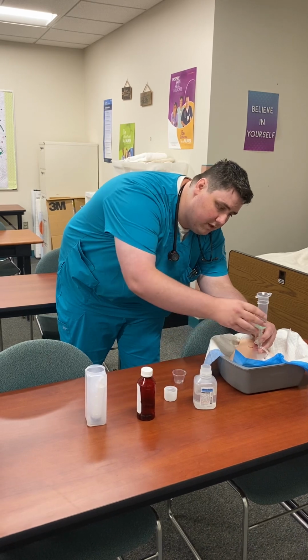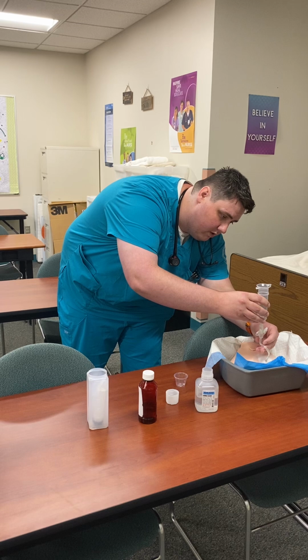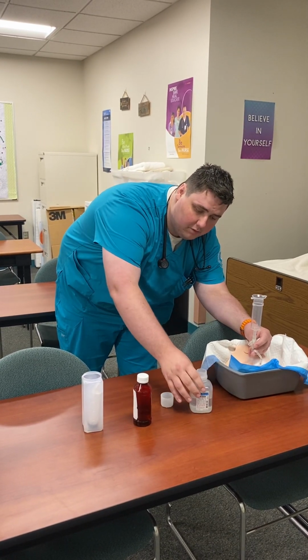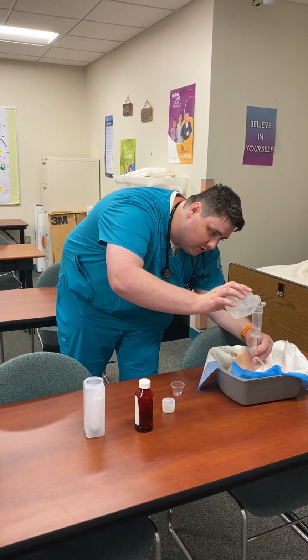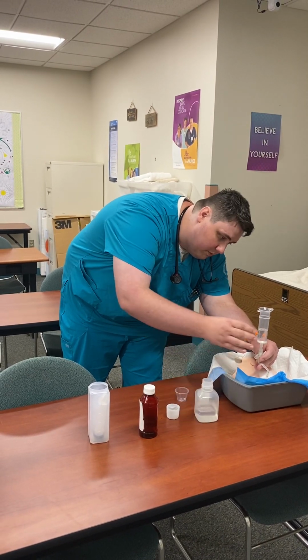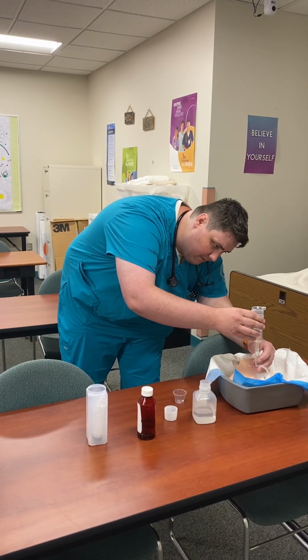You will do the same thing. You will release your med down until it is just about through, upon which you will clamp so that you don't have any water going back through. Upon which you will then add an additional 30 to 60 milliliters to flush your med through the system so that all the med is through the tubing and into your patient so they get the correct dosage.